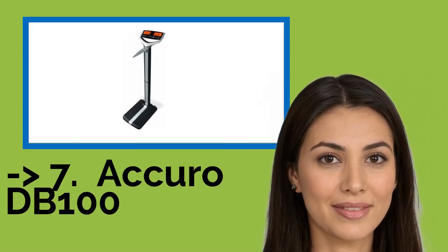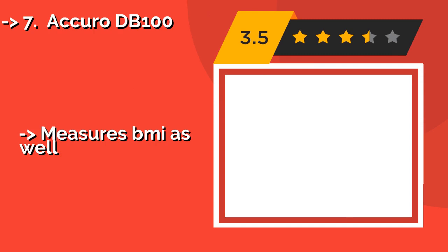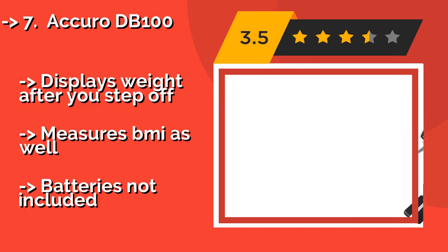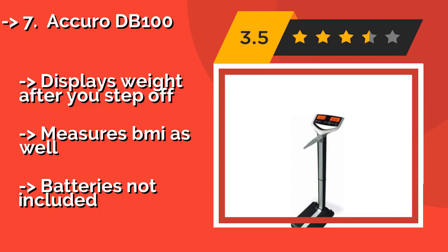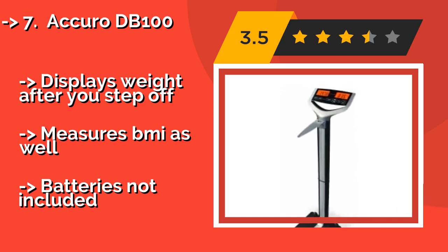The list starts with the Acuro DB100. The Acuro DB100, about $383, blends the traditional balance scale design with digital technology for easy, automatic, and accurate readings. It is powered by 4C batteries and has a low battery indicator to ensure you never run out of juice when you need it most.